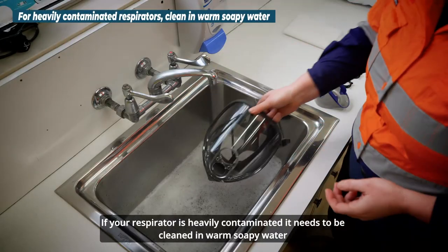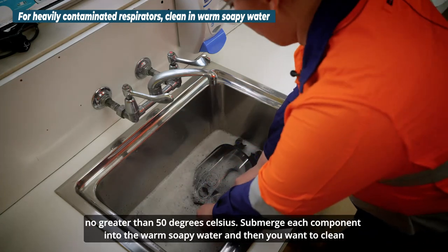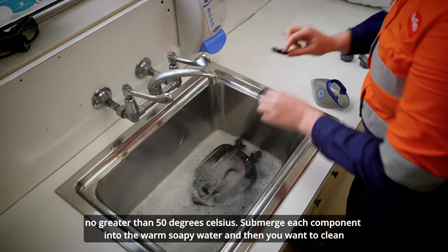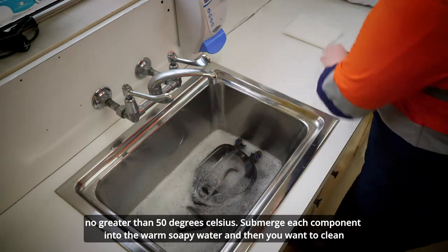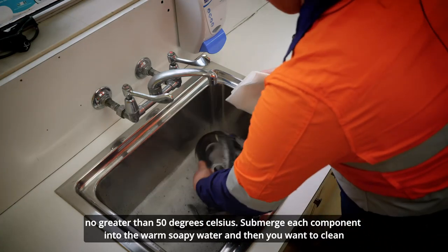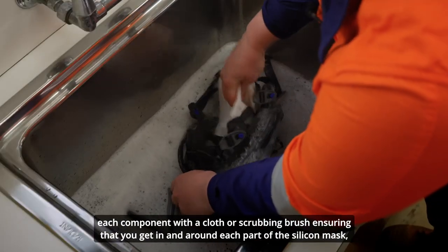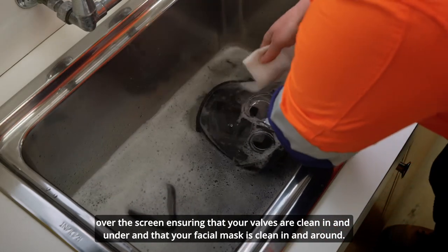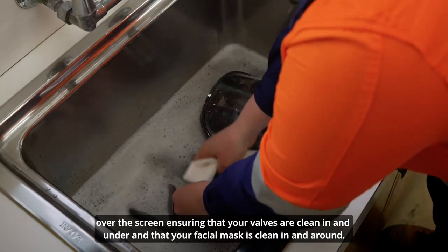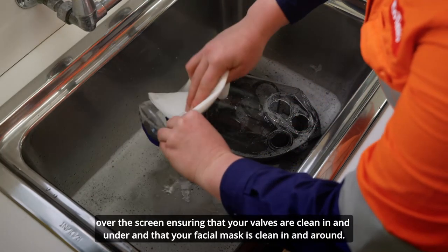If your respirator is heavily contaminated, it needs to be cleaned in warm soapy water no greater than 50 degrees Celsius. Submerge each component and clean with a cloth or scrubbing brush, getting in and around each part of the silicone mask, over the screen, ensuring the valves are clean in and underneath, and that the facial mask is cleaned in and around.